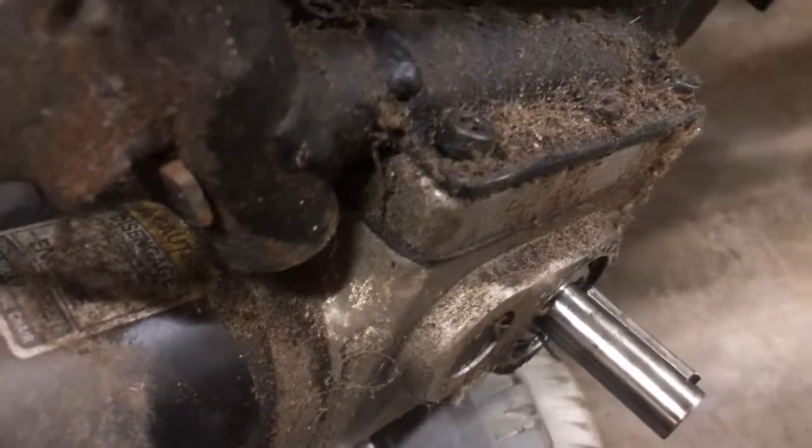This motor does have a lot of grease on it. Let's look. Okay.